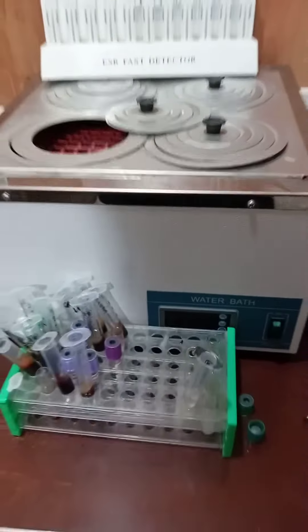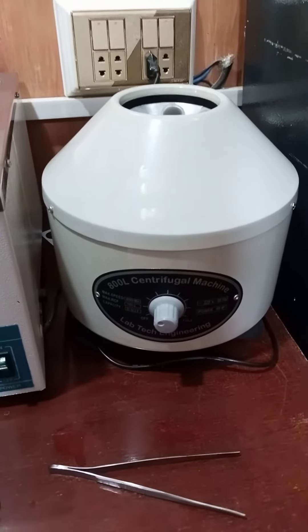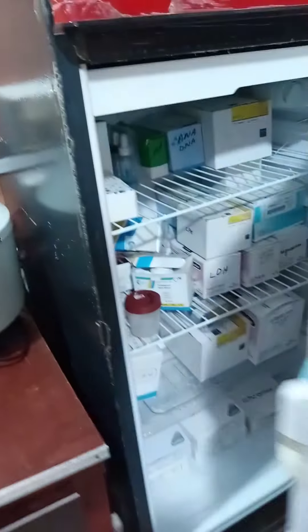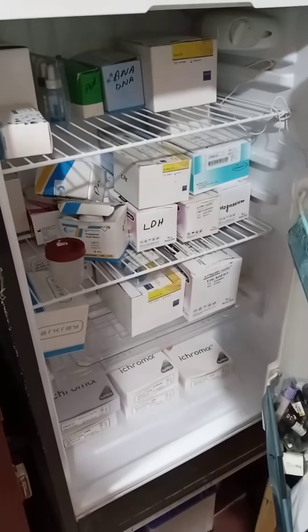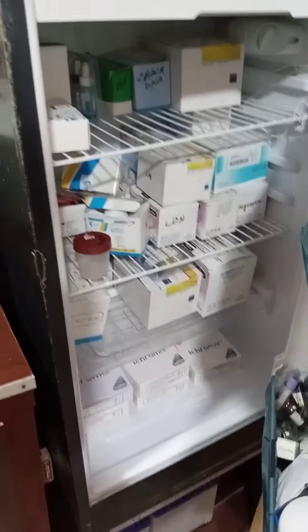This is the water bath. The most important component here is the centrifuge machine. And this is the fridge in which different diagnostic kits — LDH, magnesium, ANA, etc. — are all stored. Thank you so much for watching, take care.